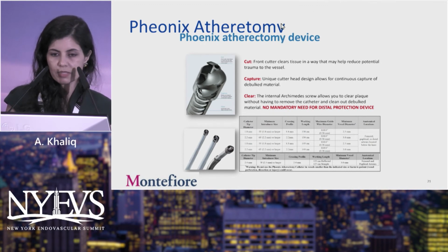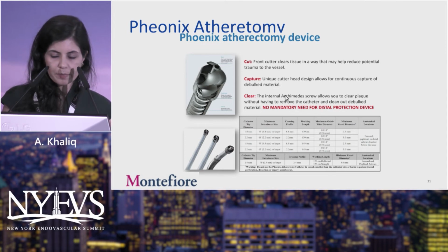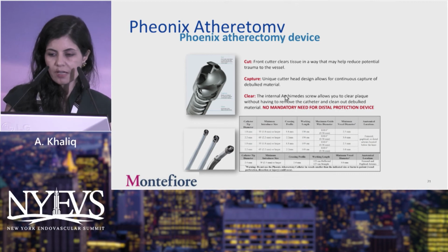Again, something similar to this, but less complicated nonetheless, is the Phoenix atherectomy device, which basically does somewhat similar things. It cuts, it captures, and it clears. However, the difference is that it has these Archimedes screws that create sort of a passive rather than an active suction.